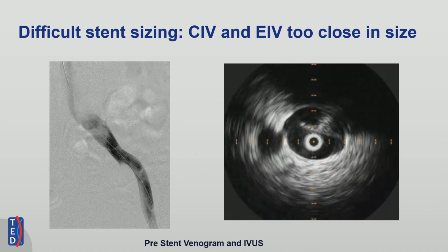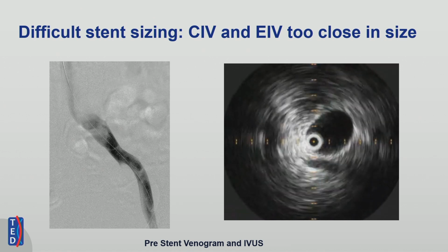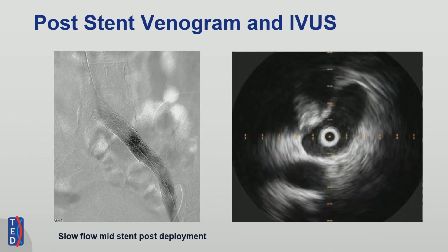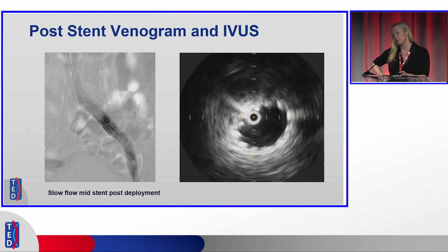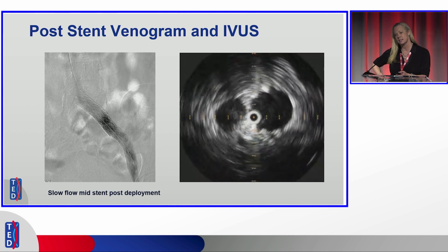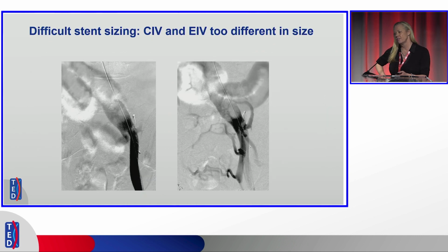Then you have to decide whether you want to oversize this stent by only 1 millimeter in the lower portion, or whether you want to go up to 4 millimeters, which can sometimes cause a disruption in flow dynamics. And early on in my experience, in this patient that measured at least 16 millimeters, if not a bit bigger in the common iliac vein, but then measured about 15 in the external and had a significant obstruction, we put a 16 millimeter stent. But it turned out this patient had very small inflow vessels, and her IVC wasn't very big, and she had multiple recurrent thrombotic episodes, even though the stents look like they're good. So over time, I've learned it's actually better to undersize the pre-stenotic dilation as long as you have at least 6 centimeters of length of the stent that is significantly oversized to anchor it.